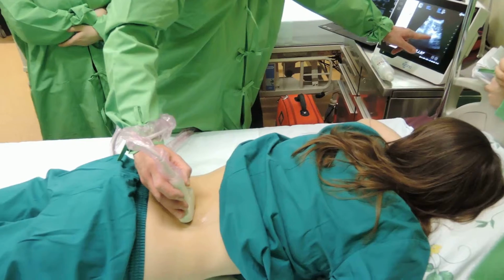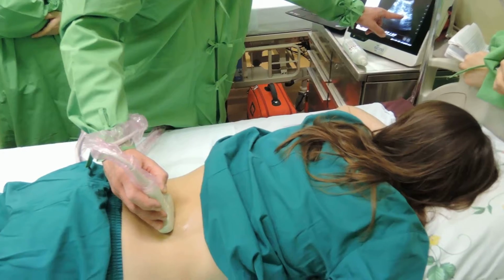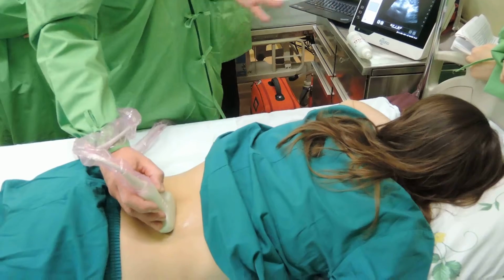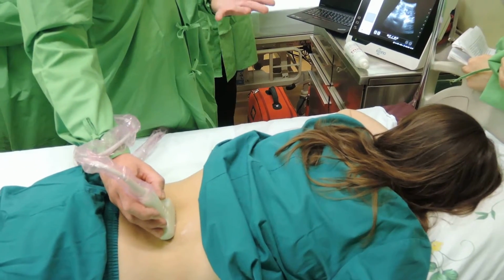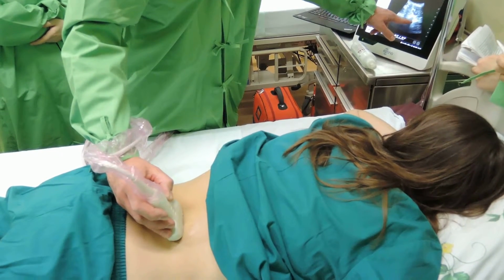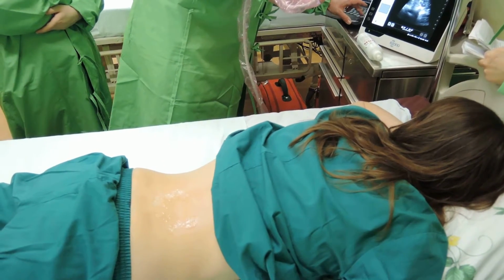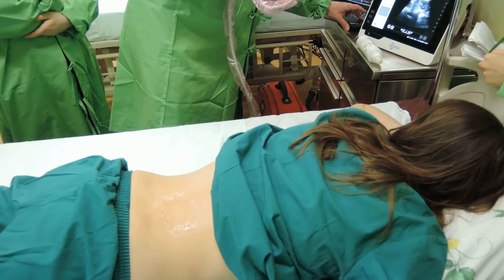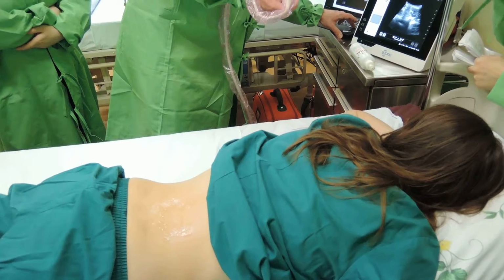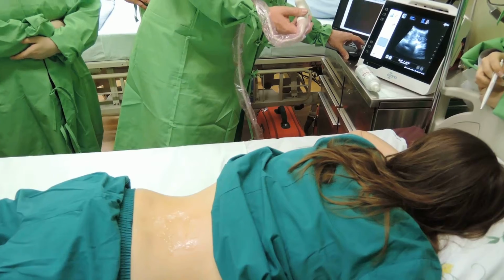The medial branches are blocked by movement of the needle in this position. This is the position to reach the medial branch. It's almost the same plane and the same technique, only the target is not the joint but this area here. For the medial branch block, he says you need to orient yourself on the lamina, the plate of the vertebral arch, and slightly below, practically where the facets are, but a little under them. And then you can block it. I'm showing it on the picture now.